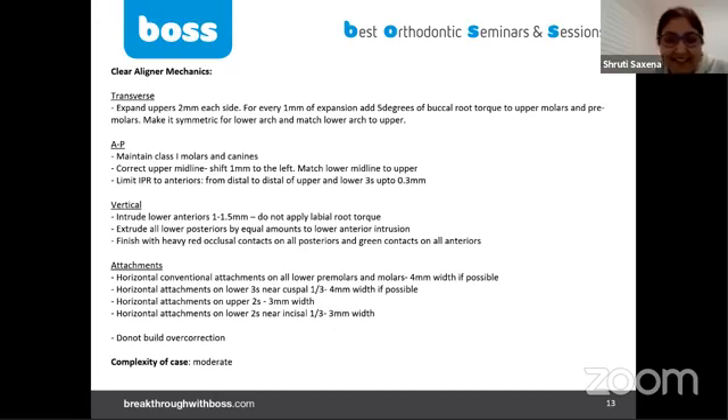We've thought about three dimensions. Transversely, we've decided not to change anything skeletally — we're doing dental expansion. I love the two millimeters each side. Why two millimeters? Because two millimeters full expression is not going to happen — there's going to be a shortfall. Why not three, four, or one? Because the plan is to combine expansion with IPR, so starting with two millimeters to see what the plan looks like.